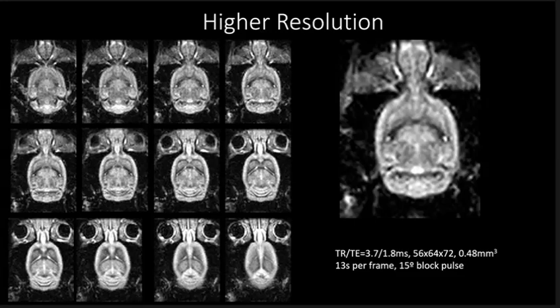And if you look at the other planes, these were acquired coronal. If you look at the axial and sagittal planes, they aren't quite as clean because of that T2 blur, but these are the most visually striking ones.